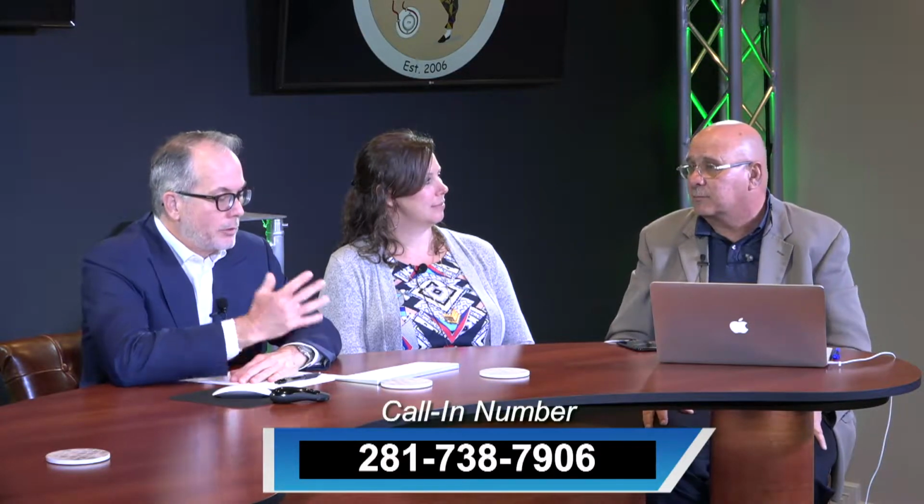Then I think that's when you just pick up the phone and say, hey, I think this circuit may need to be changed, and then we come in and we change the circuit and we go on our merry way. And that's the resolution to that. It's not really that you have to be right there. These things don't just fail acutely, but should they, it doesn't matter if I'm standing there or not. If it fails, it fails. There's nothing I can do. So if there's a model that has, at the other extreme, perfusion on one end, nurse or respiratory therapist on the other end.